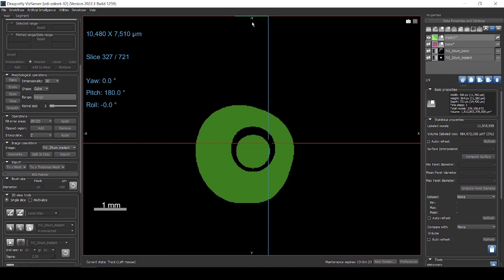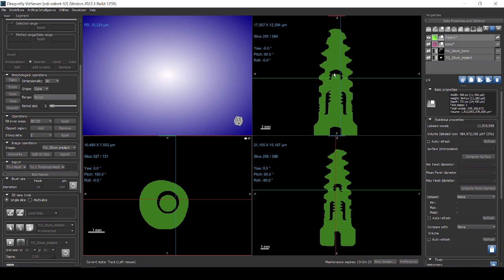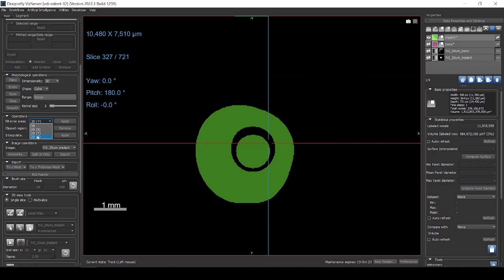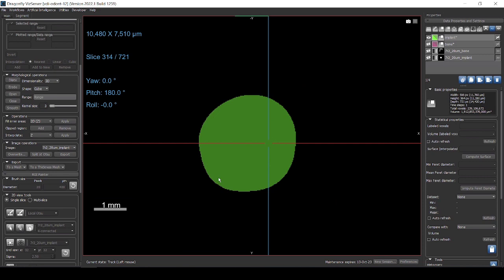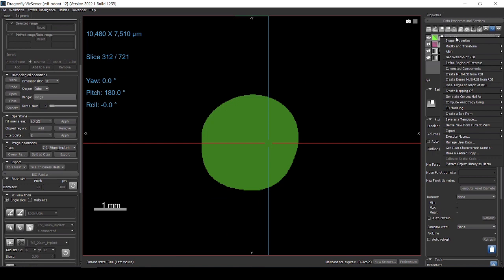And why is it? Because now we're looking at the plane X, Y. So when you select the Z, that means that it's going to look at the Z axis that is coming out of the screen in this case, and it's going to fill everything that is in this plane that we're looking at here. So of course, if you want to use other planes, it could be tricky. In this case here, on the top, you have the X, Z, that means that you have to select the Y, always a complement. So in our case, we're going to select this one. So we're going to fill in this one, apply. That's it, it's filled. So you can look at this. And on the other plane, you can see that it's all filled up.